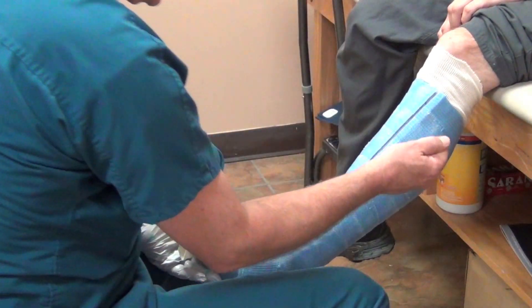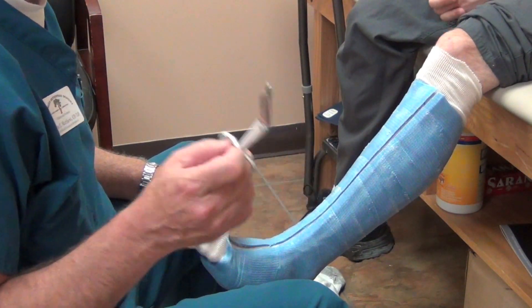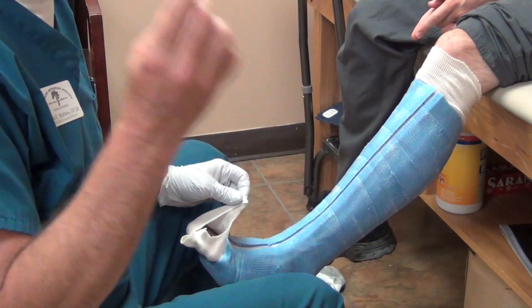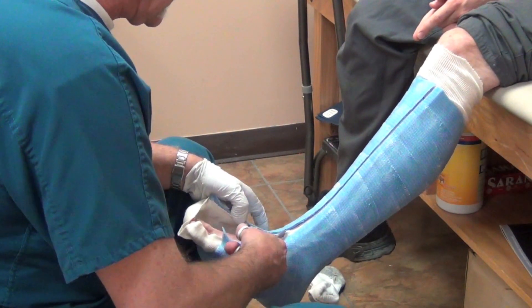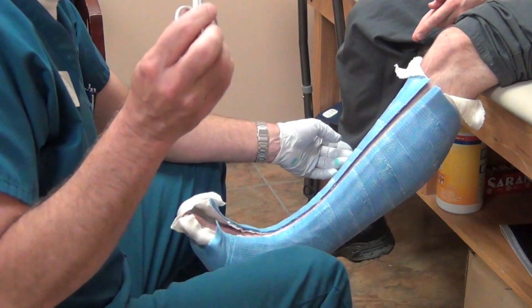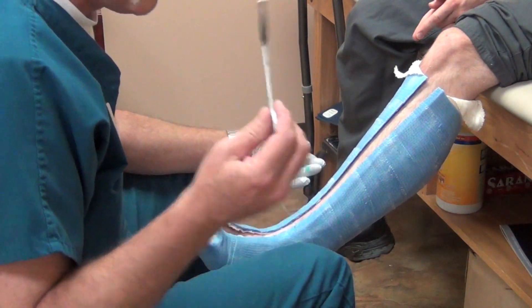The main thing is not to stretch your casting material — get a good, nice model. I'm a big advocate for using good bandage scissors. These scissors are going on three years old — same pair. They were powder coated and now they're filthy just from the oils in my hand. Same pair for three years casting patients every day and numerous patients, and they still work like a dream. They cost about $30 for a pair. You can get six pairs of the cheap ones for the same price, but you'll go through 40 pairs of the cheap ones while I'm still using these. Just make sure it's German steel — they're amazing.